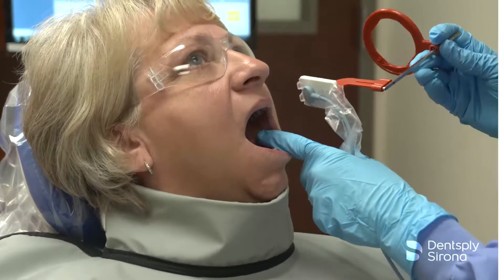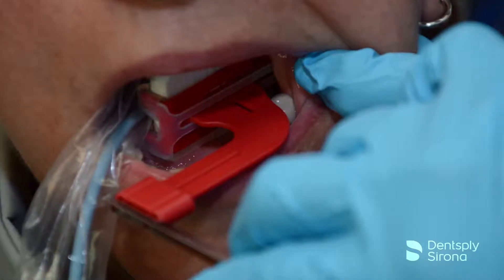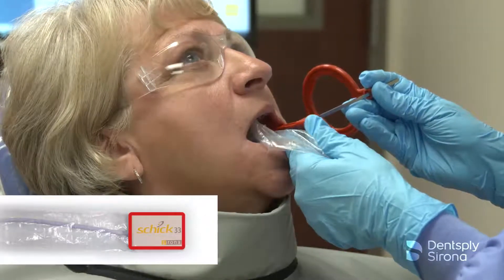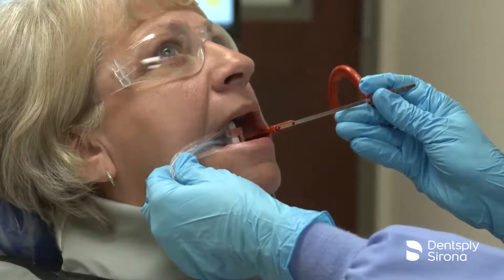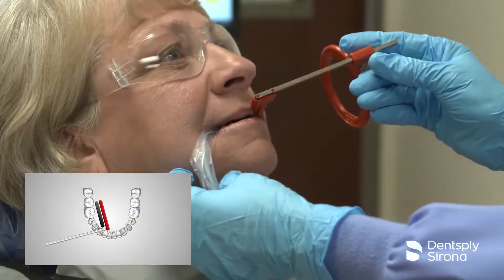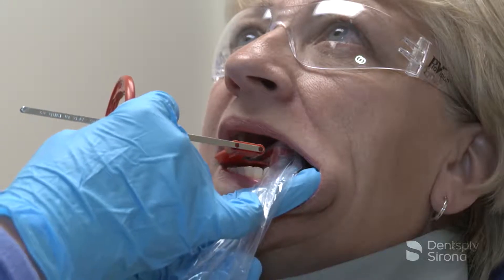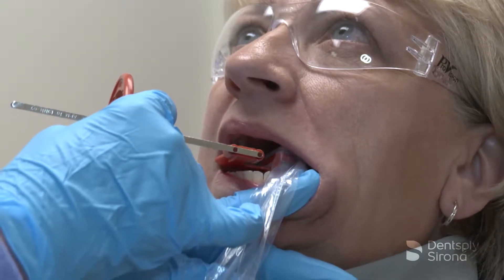As displayed here, the clinician aligns the interproximal indicator slot with the interproximal spaces to ensure open contacts. Due to the inactive portion of the sensor or limited access, a cross-arch placement of the sensor may be necessary, along with an adjustment to the horizontal angulation of approximately 15 degrees distomesial to achieve a quality diagnostic radiograph. The following video demonstrates this adjustment to allow for premolar bite wings with optimal diagnostic information.